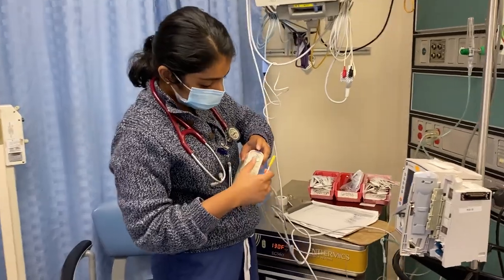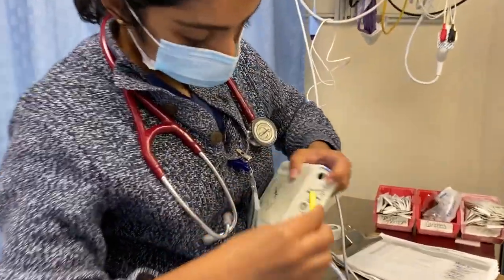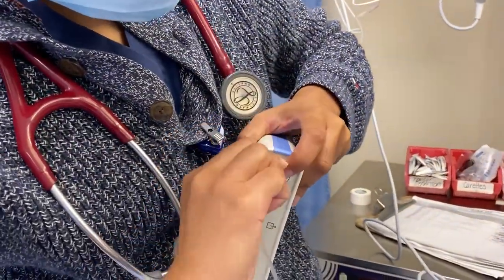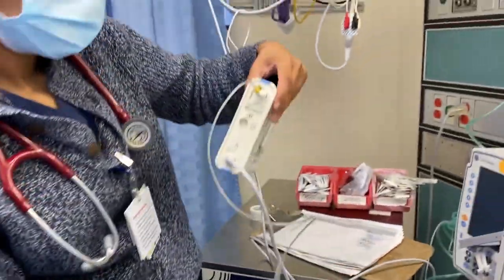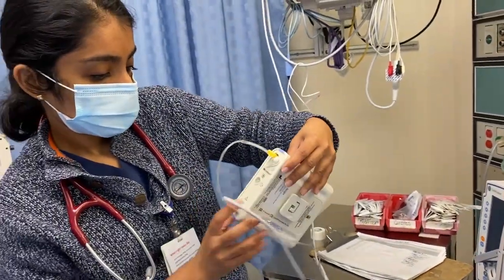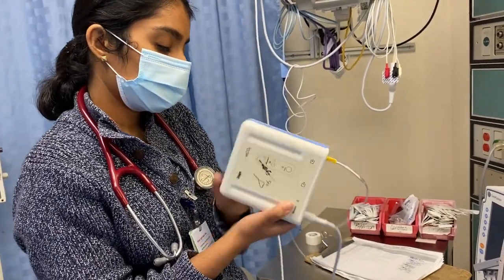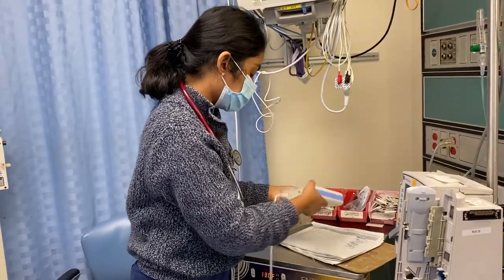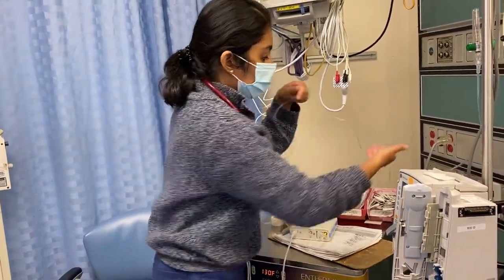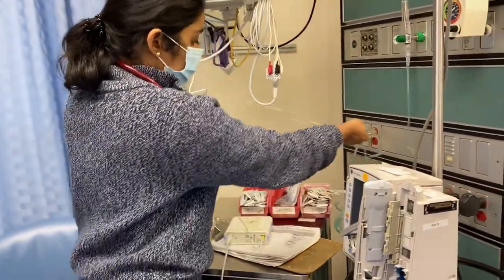This little piece will go into the top portion of your end tidal CO2. It screws in like so. And then it vibrates a little bit once it's all hooked up, right? Yes. It tells you that it's connected.